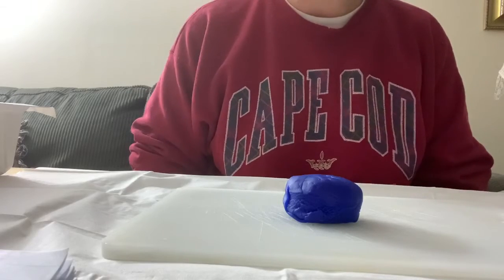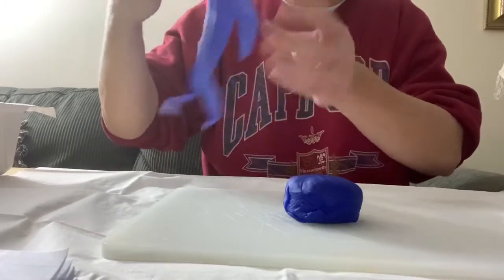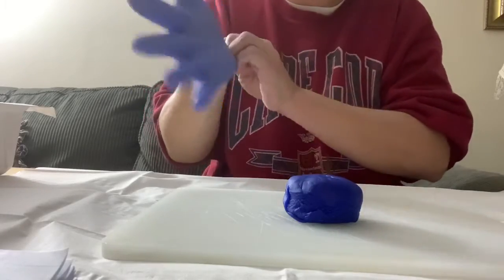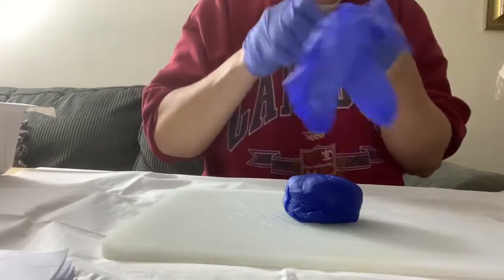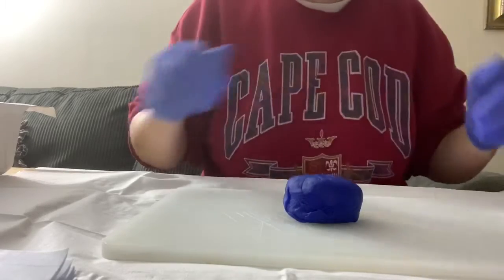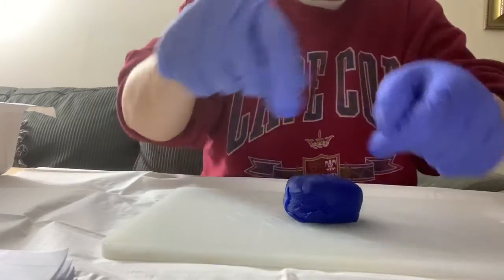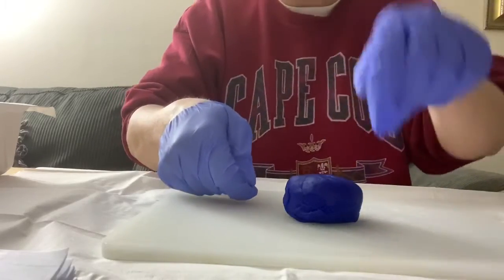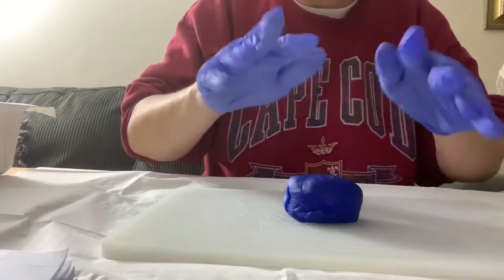The first thing I'm going to do is perform my hand hygiene, and put on a clean pair of gloves, just regular, non-sterile gloves. First, I'm just going to clean the peri area using regular soap and water, just wiping from front to back on either side and down the middle.